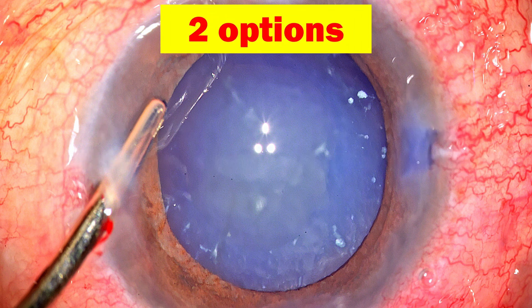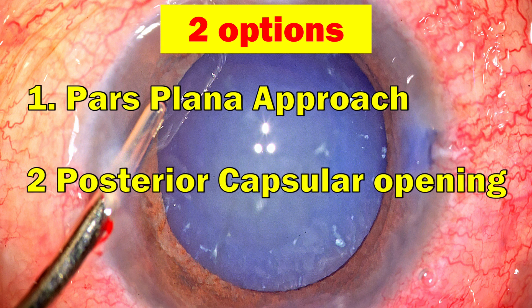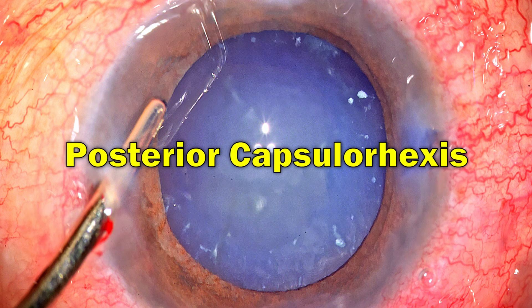There are two options to deal with this. You can go through the pars plana approach, but in this situation I prefer to do a posterior capsule opening and then through that opening go into the Berger's space and do a limited anterior vitrectomy to clear off all the cortex and lens matter. Moving on to performing a posterior capsulorrhexis in this eye.